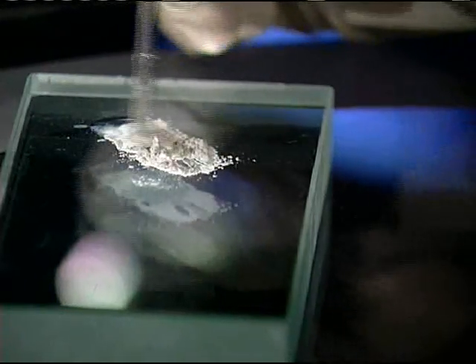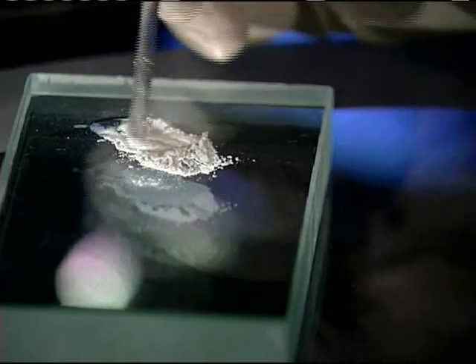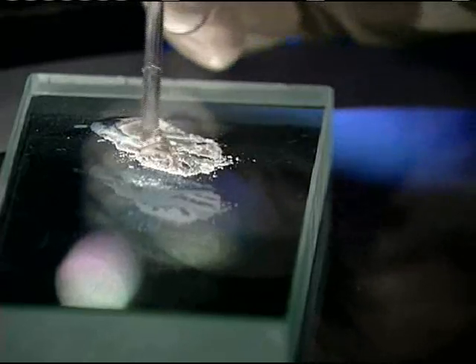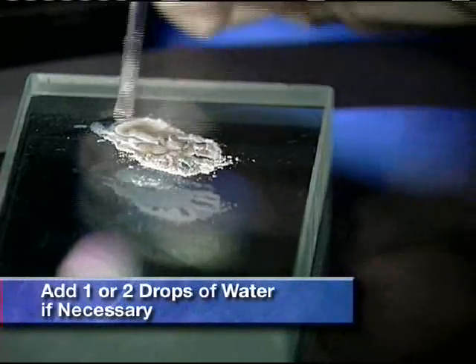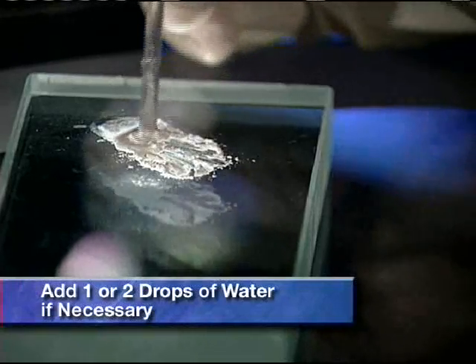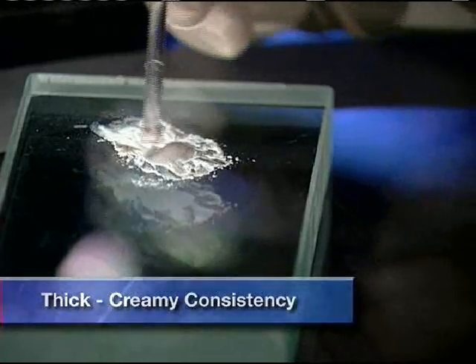In the vast majority of cases, this mixture will provide the proper consistency necessary for easy placement, condensation, and final set strength. If you find the ProRoot MTA mixture is too viscous or stiff, one or two drops of sterile water may be added. The mixture should be a thick, creamy consistency.